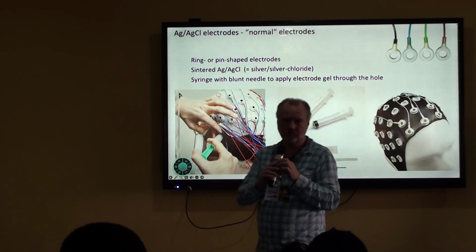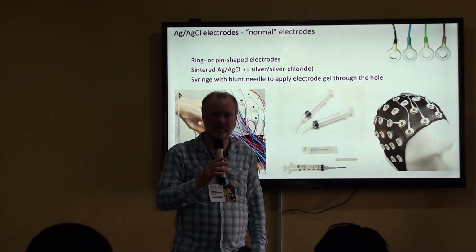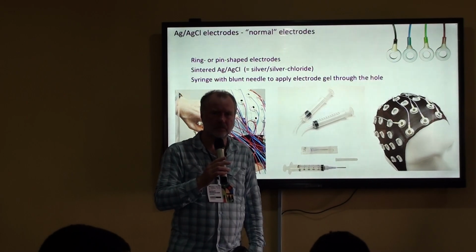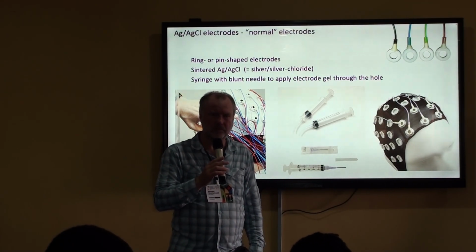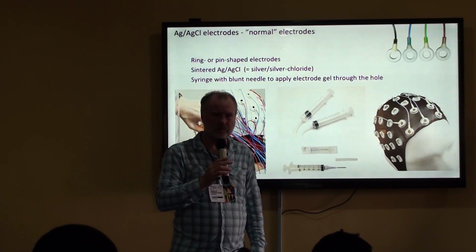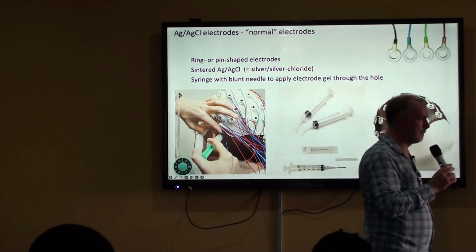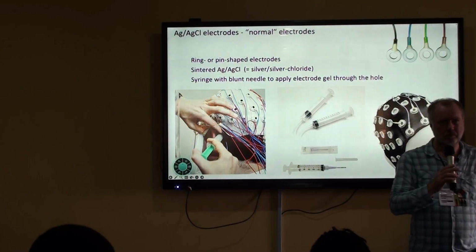Okay, thank you. I'm sorry to be back again. My first observation is we've not talked about EEG video telemetry. And the second question is, if I were looking at developing a portable EEG device for an epileptic patient, would I still use any of these EEG caps to design a portable device for the patient, or would I have to modify some of the caps, increasing or removing some of the electrodes in order to achieve this?